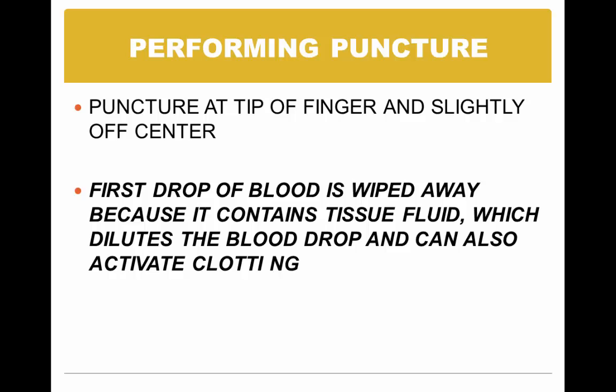Then you want to wipe away that first drop of blood because it could contain tissue fluid, which also dilutes the blood drop and can also activate clotting. And then we also talked about using alcohol in that if it's not completely dry, that can alter your results as well.